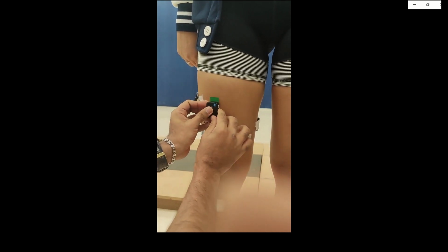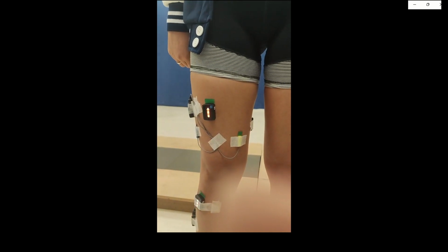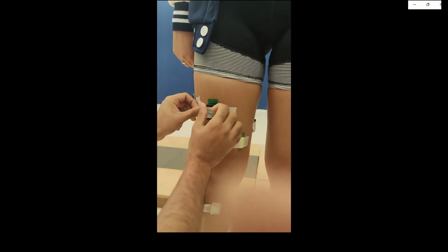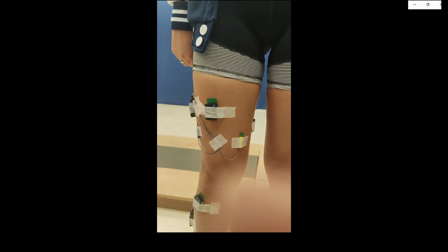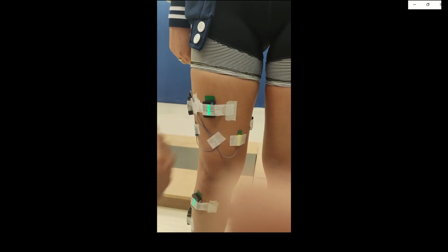These are DELSYS EMG and IMU sensors. Behind each sensor is surgical grade double-sided tape, so it sticks to the person's body. But I put a piece of surgical tape on top as well to ensure that the sensor doesn't come loose when the subject is walking or moving around.